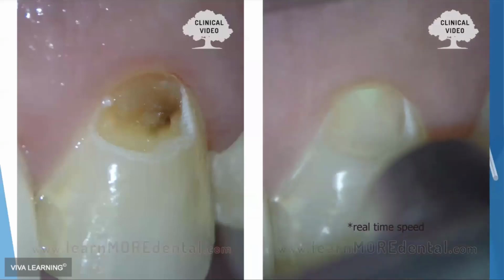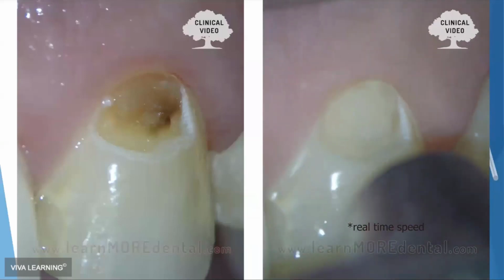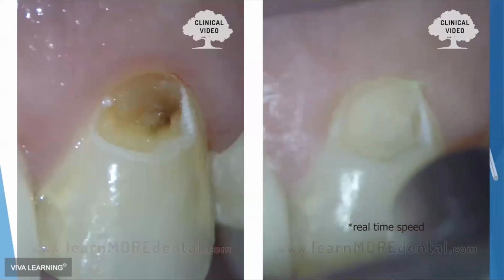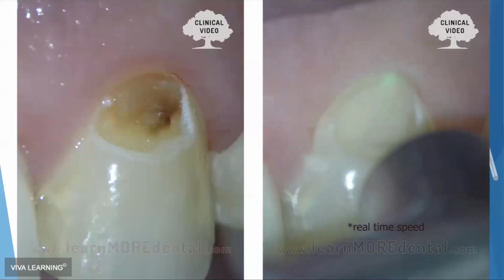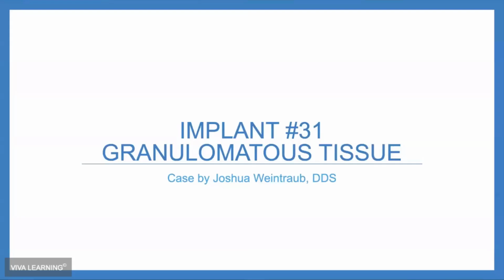And then, of course, we're re-angled here. The caries is almost completely gone, but the gingiva is right over our margin. So, same setting as caries, you can just roll over the tooth and give yourself a little restorative room without inducing any kind of bleeding. So with that being said, you kind of see how it interacts with normal general dentistry type situations.